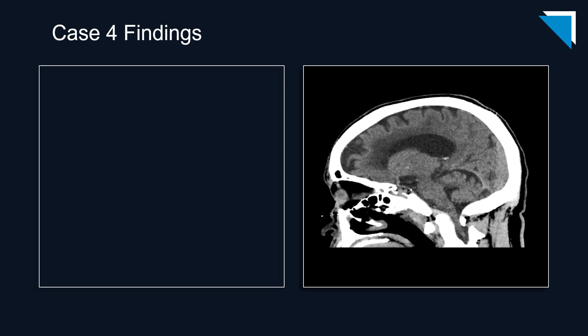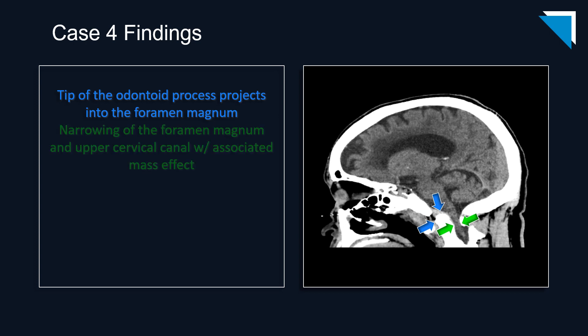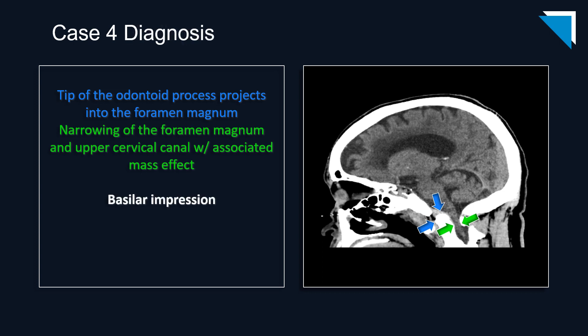Here is a single slice from the sagittal series. Note the tip of the odontoid process projecting into the foramen magnum, resulting in mass effect on the upper cervical cord. This is a case of basilar impression. It's not something we typically look for, but it should be included in your search pattern, especially when you have the reformatted images.